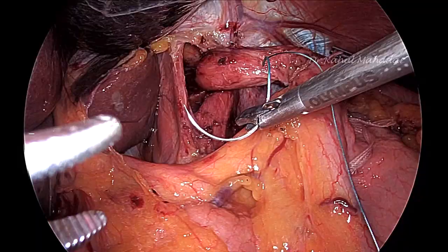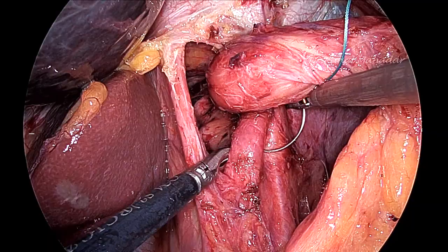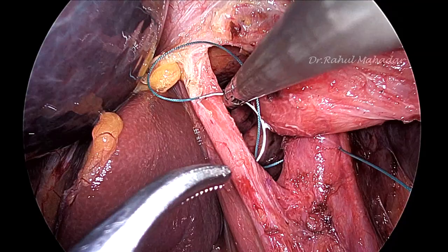First do the crural approximation. Here we are using Ethibond 2-0 sutures. While doing this suturing, you should see the entry point and exit point of the needle, because there is a high chance that in this area you can injure the aorta below. So you have to be very careful.